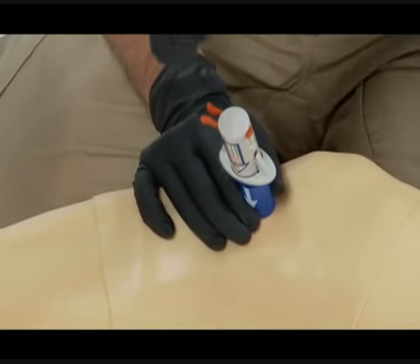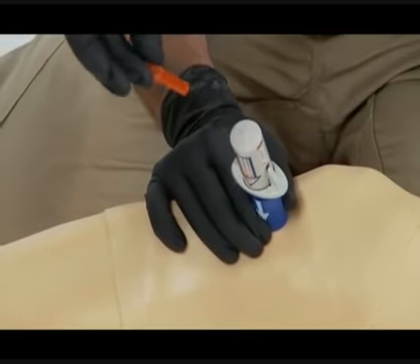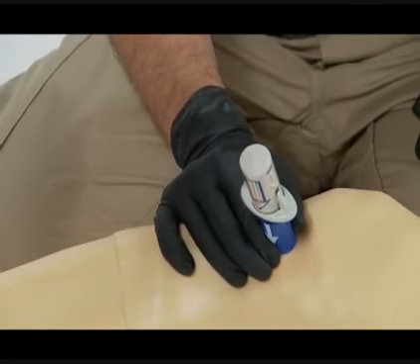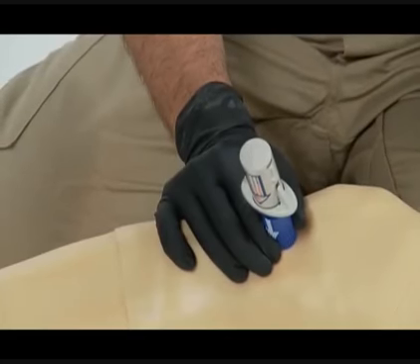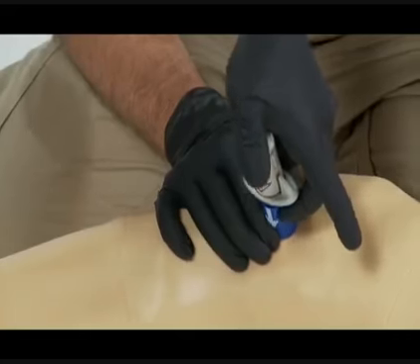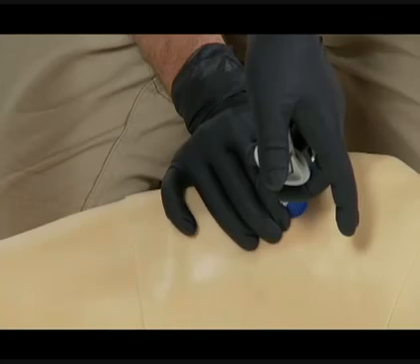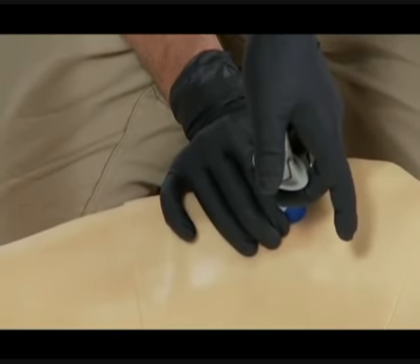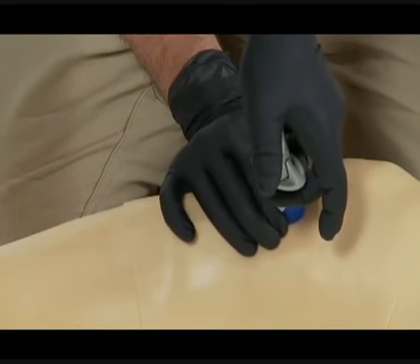While holding the barrel firmly, pull out the red safety latch with your dominant hand by squeezing the 2 sides together. Do not discard the red safety latch because we will use it again later. While continuing to hold the barrel firmly against the site, place 2 fingers of your dominant hand under the wing portion and the palm of that hand on top to stabilize when triggering. Use consistent and gentle downward pressure to trigger the BIG. Note that no extra force is required.